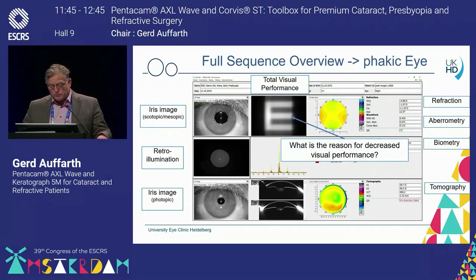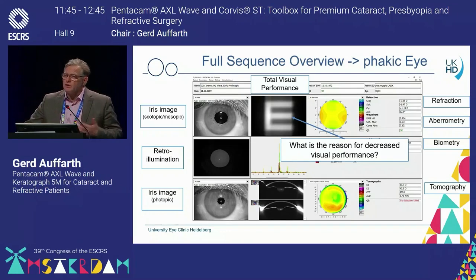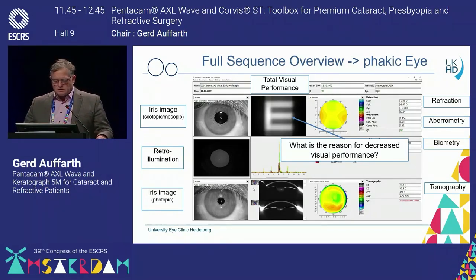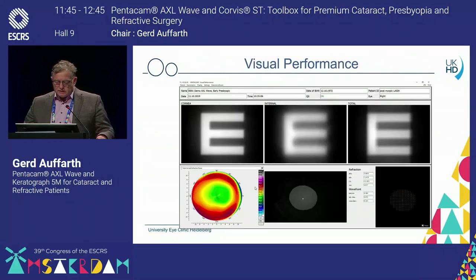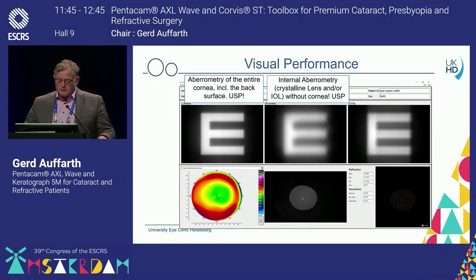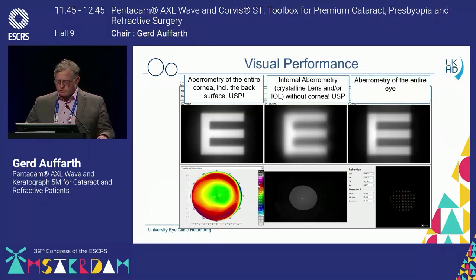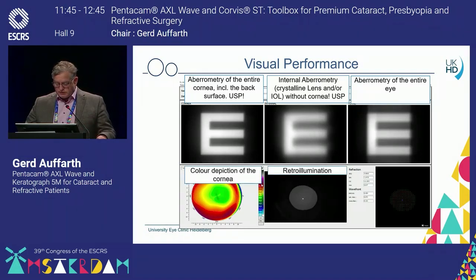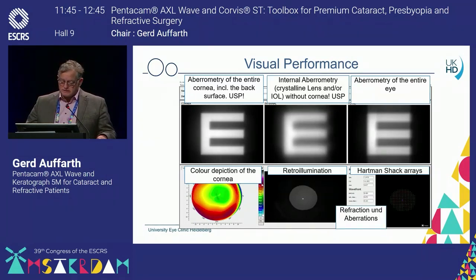One would like to ask what's going on, why we have such a funny total wavefront here. If you look at it, you differentiate between the corneal wavefront — aberrometry of the entire cornea, including the back — and the internal, which would be the lens or the capsular bag with an intraocular lens placed in it, and then the sum of it, the aberrometry of the entire eye. You can look at the cornea, the retroillumination, and here the Hartmann-Shack arrays are listed — refraction aberrations. All this can be seen in one picture.